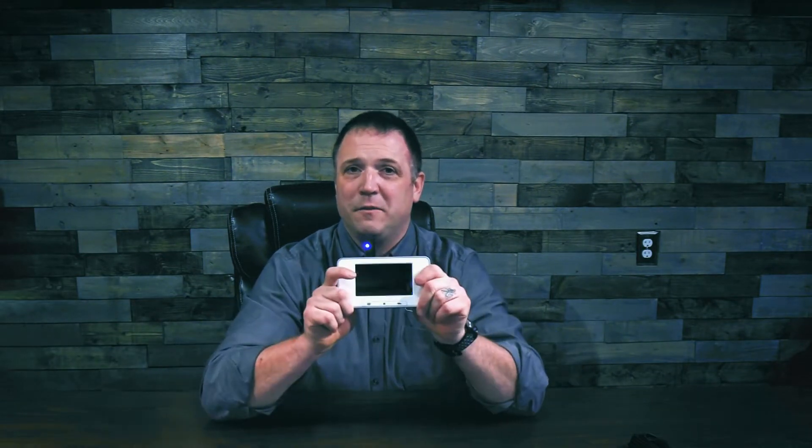Hello, I'm Justin Ross with Fluke by Medical and RaySafe, and I'm here today to talk to you about yet another new product, this time for the RaySafe line, specifically for the RaySafe X2.